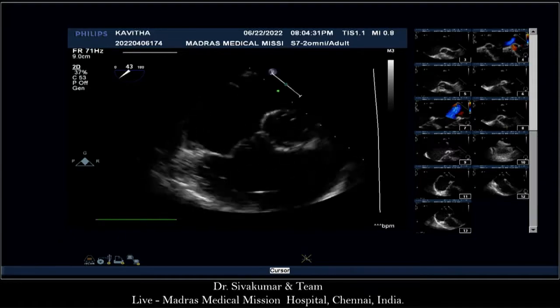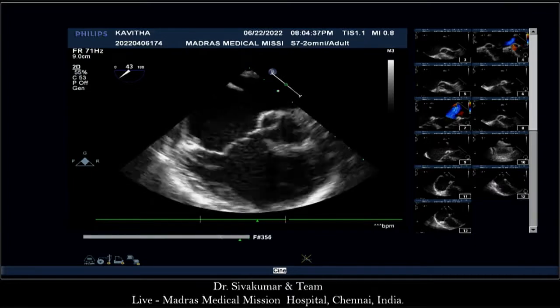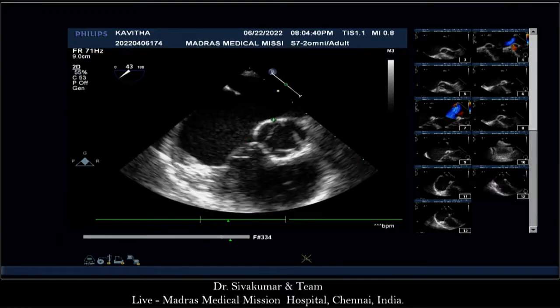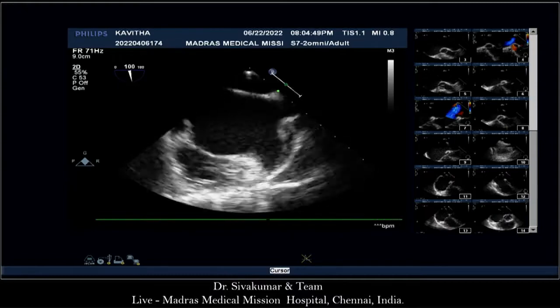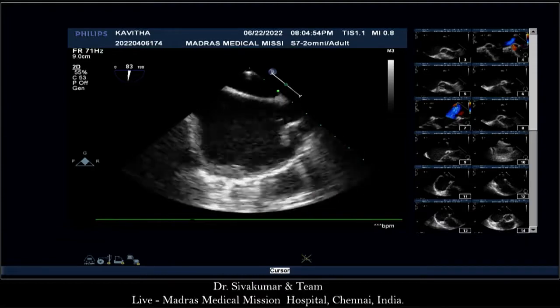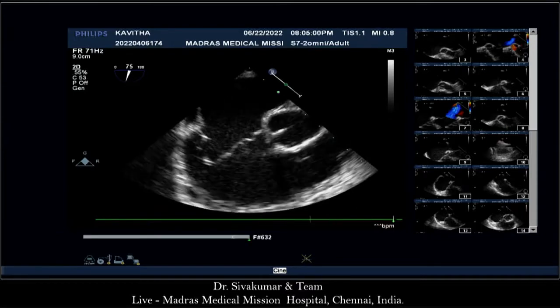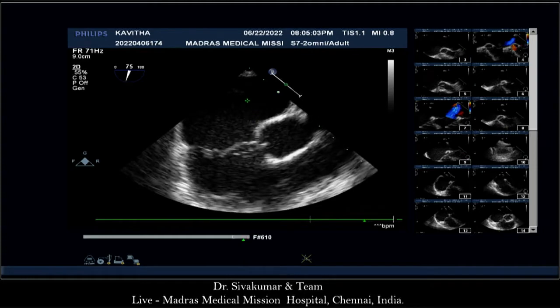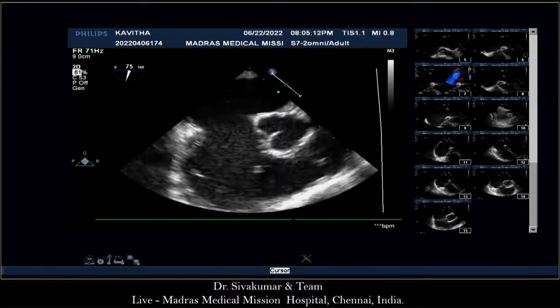So this is a 45-degree view, which is showing a deficient retroaortic margin, a good posterior margin, and it measures around 24 here. To the bicaval view, 90-degree. Okay. Show below. It's 25. So the maximum measurement was 31 in the apical 4-chamber view. And other rims look adequate.